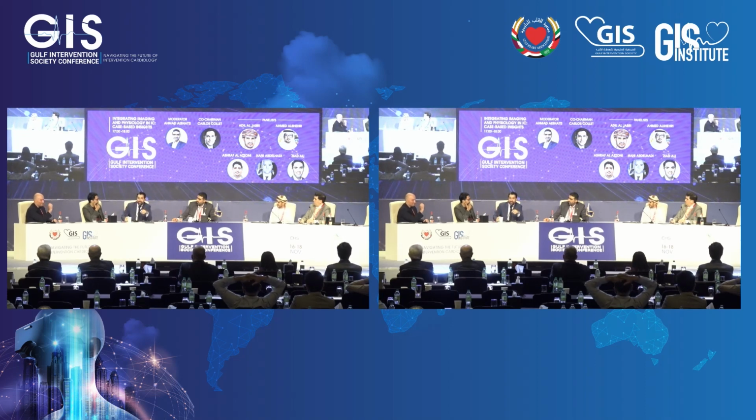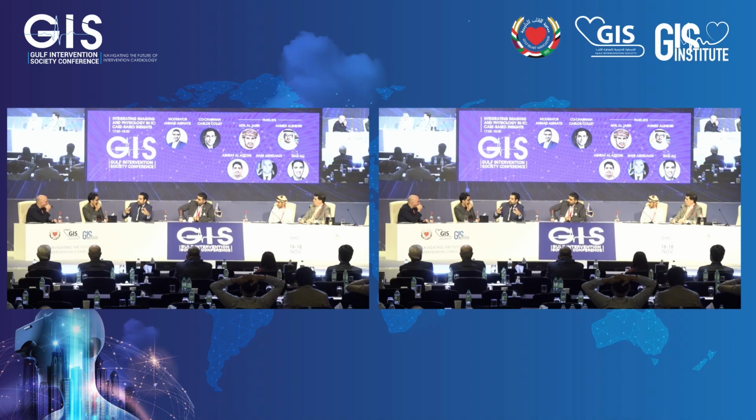So then we started looking at these cases, why the FFR is not 1? And I'm going to be honest with you, we don't know. But we have in PPG Global 1,000 patients, diffuse disease, treated with imaging, long stents, doing everything the best you can. You simply cannot increase the flow. It appears to be, in my hypothesis, a phenomenon related to the diffuse atherosclerosis plus vessel size. So these are some of the limitations that we're starting to understand about diffuse disease. And I think we're just starting. This field is just starting.